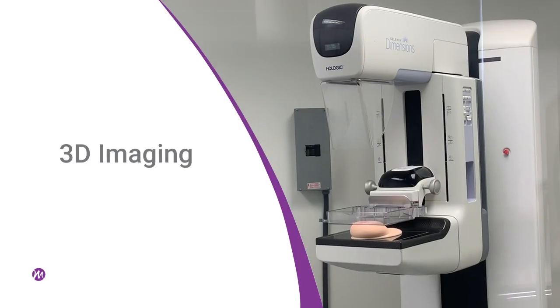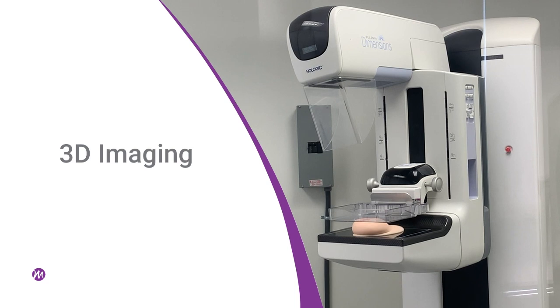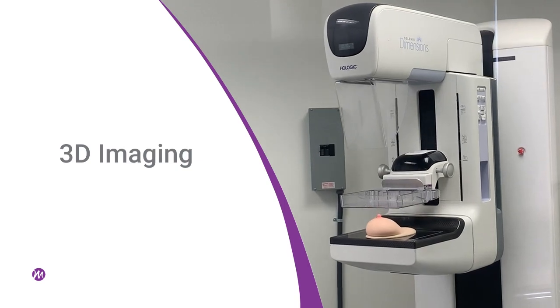With the 3D mammogram though, the breast is again compressed from above and below and from side to side. The X-ray tube actually takes multiple views over each breast, kind of in an arc. And the computer then regenerates those pictures, gives us multiple slices of that breast, and then we're able to kind of look through the tissue almost like we're looking through a loaf of bread. And so we can then scroll through that tissue from top to bottom, from left to right. So it gives us much more information with a 3D, and we don't have to try and figure out, is that just tissue sitting on top of each other? And we're able to see, is there actually something sitting inside that tissue?